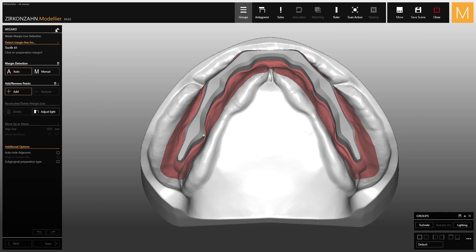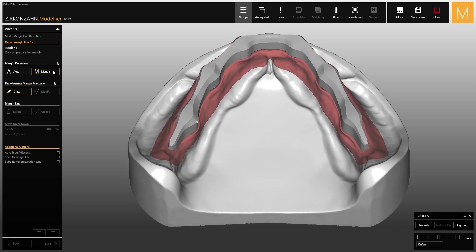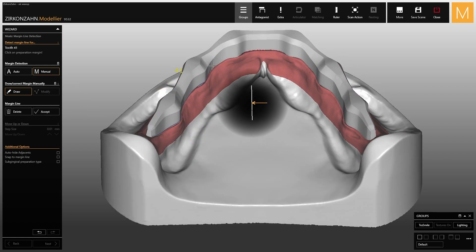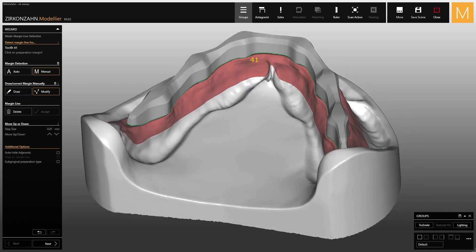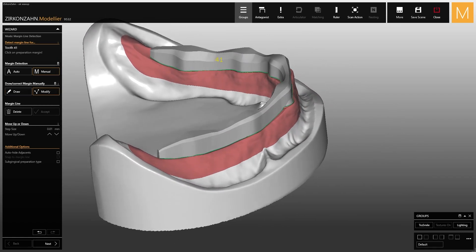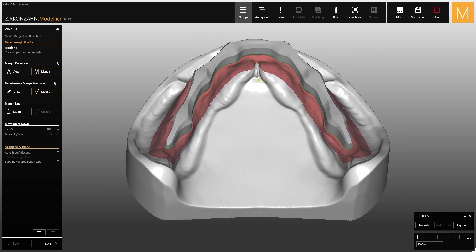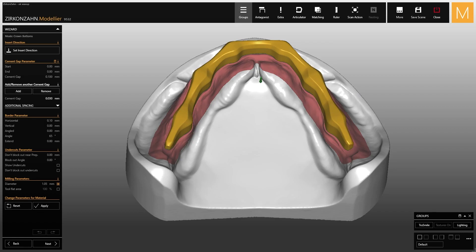After that, go back to the wizard and draw the closing margin on the bar, making sure the bar is a closed scan. If not, close the screw seat with wax before scanning. Once you have drawn the marginal closure, you can increase or decrease the cement space according to your or your dentist's needs.